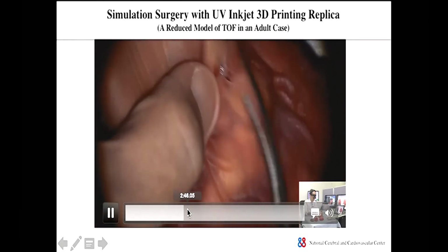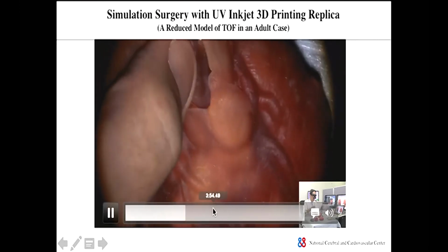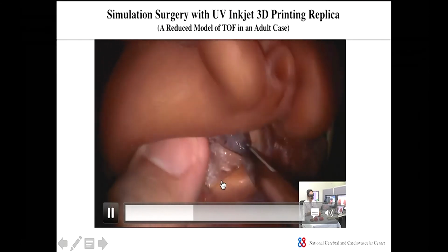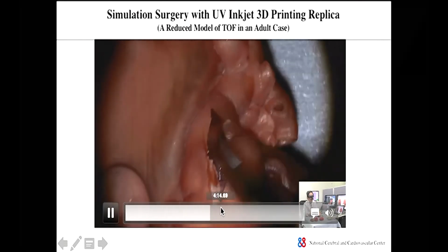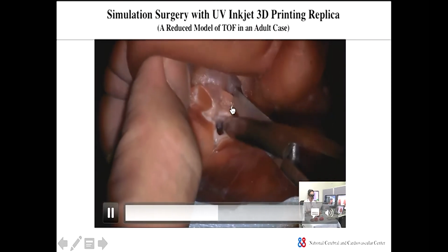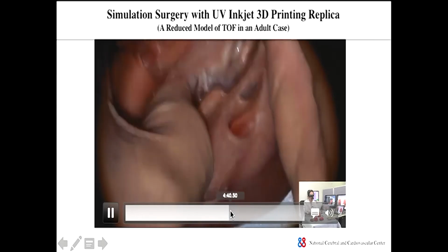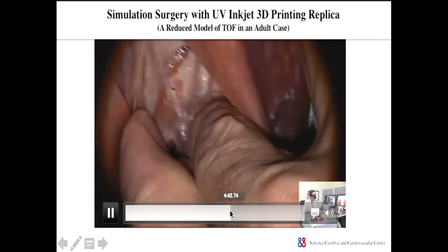And he's going to cut the stenotic pulmonary artery trunk. And this is a very small pulmonary artery. Pulmonary valve and subpulmonary stenosis, very narrow. He cut the arterial tract and RVOT tract, and then enlarged the RVOT tract.